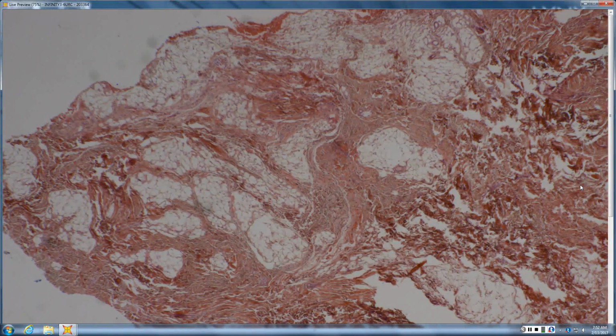Like a fibrous histiocytoma. So fibrous histiocytoma, which is basically dermatofibroma, would be one thought. Spindle cell lipoma. So a mature spindle cell lipoma, which becomes a fibrolipoma, or a mature fibrous hamartoma of infancy. So either one. Either fibrous hamartoma of infancy that becomes mature, or a spindle cell lipoma that has just matured into a fibrolipoma. So late stage of one of those two things.